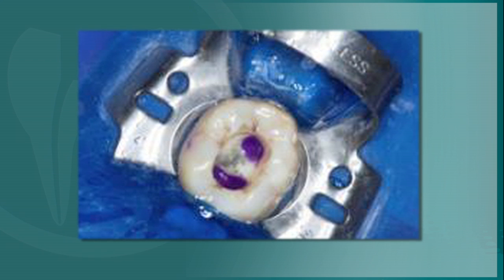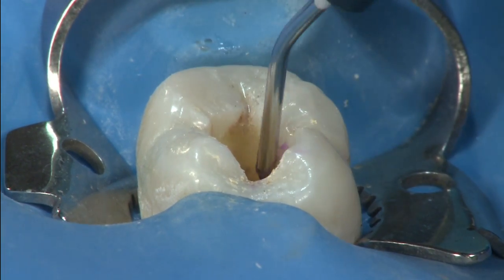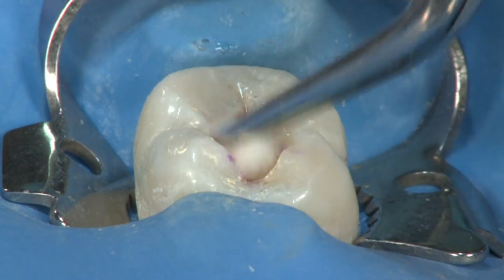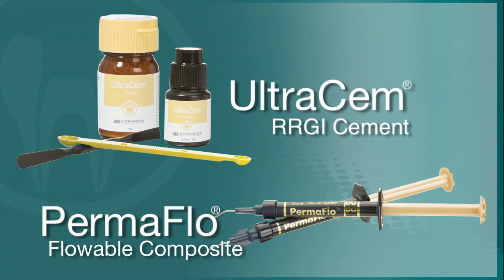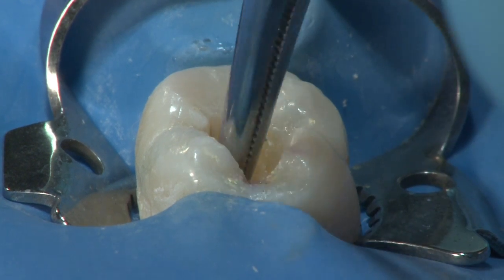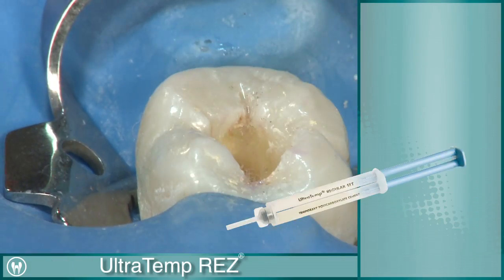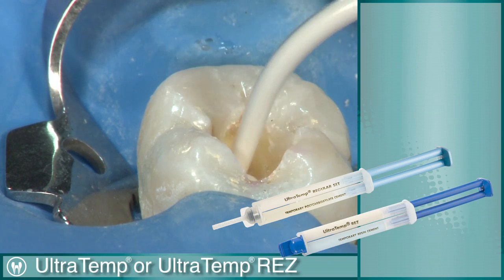This will help to prevent damage to the seal and pulpal floor. Permaflow Purple can then be placed over each orifice of the entire pulpal floor. Be sure to clean excess Permaflow Purple from the chamber prior to light curing. Additional flowable or resin-modified glass ionomer may be placed. Temporization of the coronal aspect of the tooth can then be achieved by placing cotton pellets and closing with a firm temporary cement, such as Ultratemp Polycarboxylate Temporary Cement or Ultratemp Res.